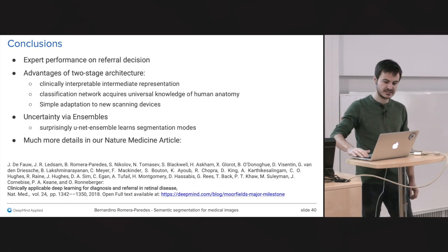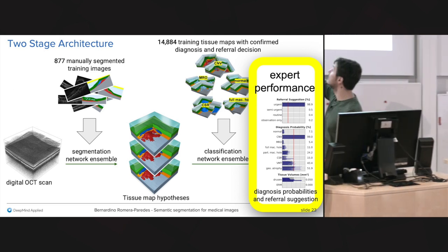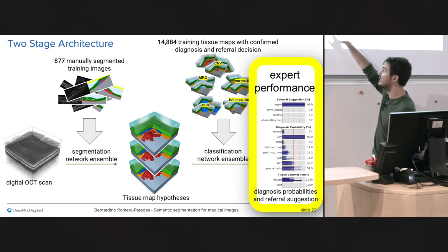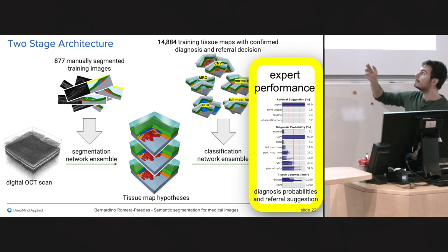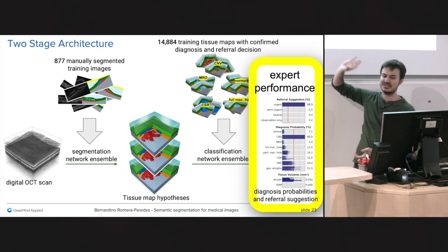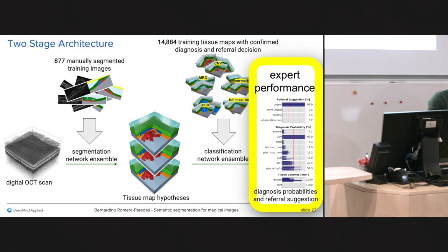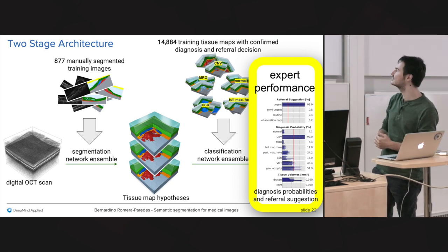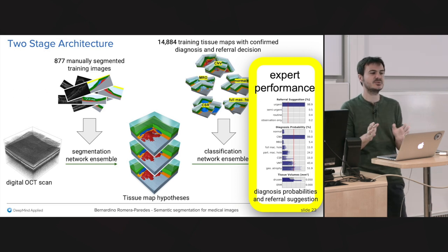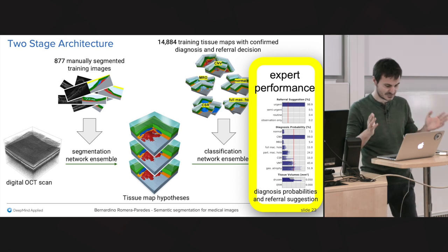There are several things. If you train everything end to end and don't pay extra care, what may happen is this: the input of this network is the pixel-wise probability instead of just the labels. By training end to end, the network may somehow learn to encode extra information in the probabilities that is not in the labels. We saw that might happen, but technically it was also quite difficult to fit everything into memory. We made some efforts in that direction, but in the end we decided to keep things simple for now, at least, have this working, and then see if we can make something like this.